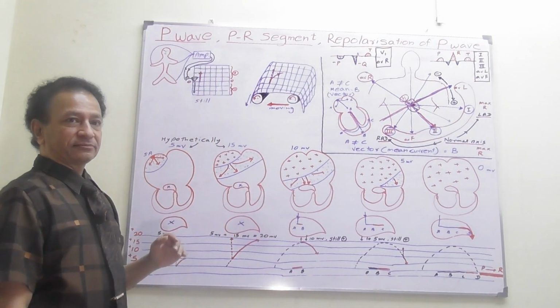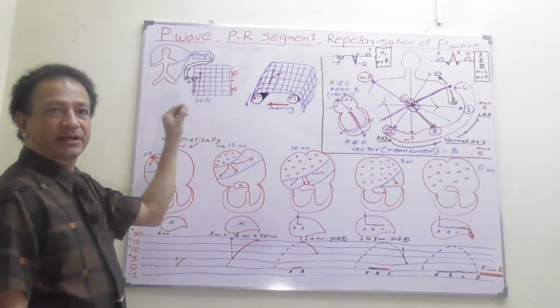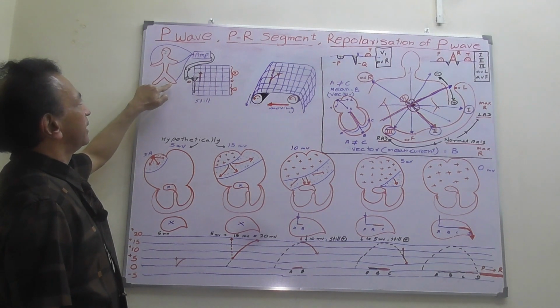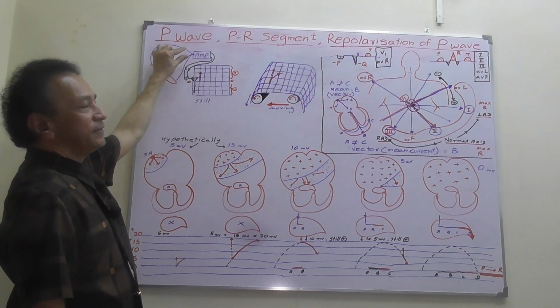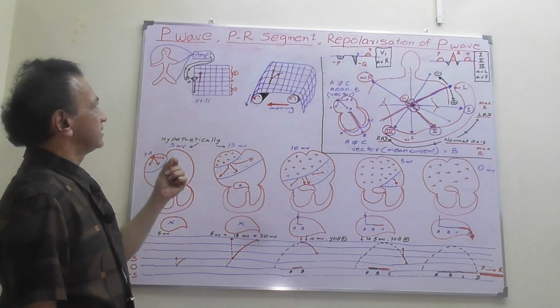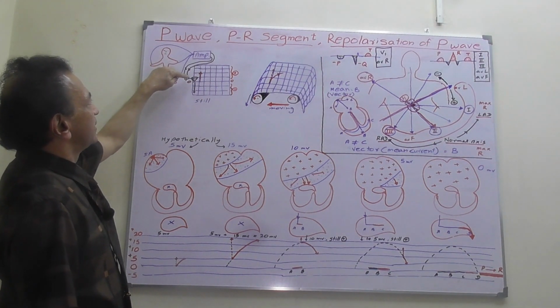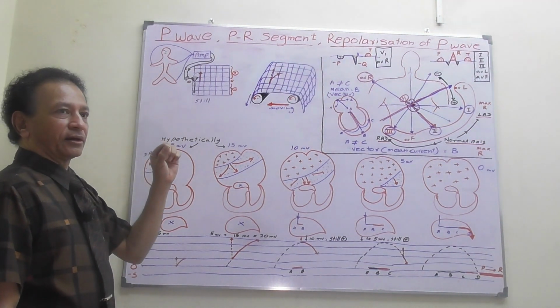So before starting, we should realize how the ECG is documented on the ECG paper. We connect the patient to the right arm, left upper arm and the left leg, and all the leads get collected together. With the help of the amplifier we amplify the wave, because it's a very small wave current. We amplify it and we get the positive and negative currents, and we connect it to the needle where you have ink.